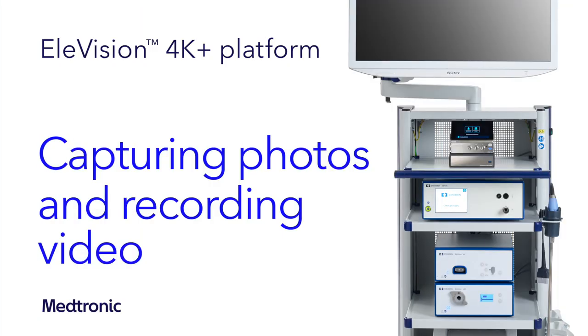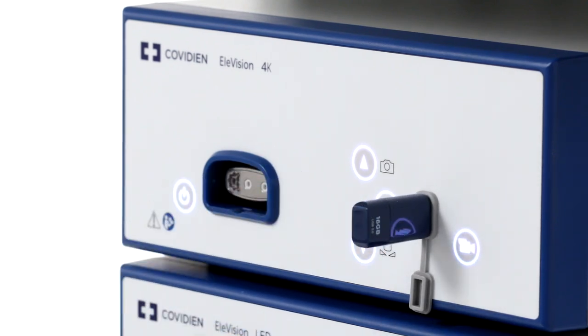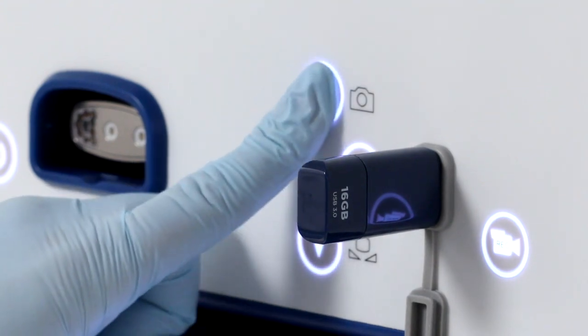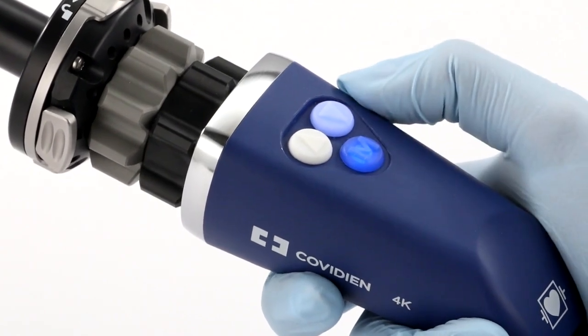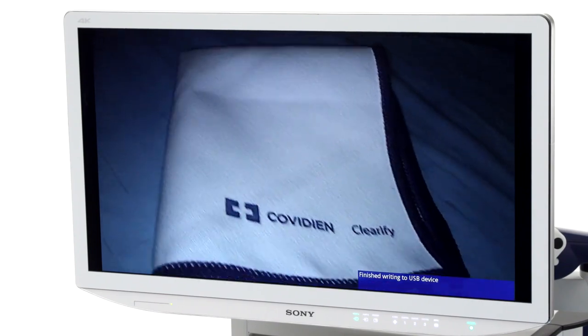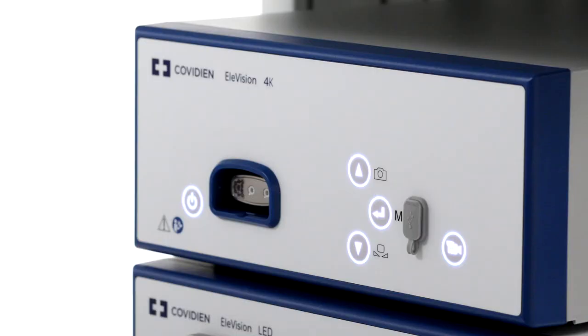Next, I'll walk you through taking a photo. Capturing a photo using the Elevision 4K Plus platform is quite simple. The first step is connecting a USB storage device to the front of the CCU. You'll want to make sure to choose a device with ample storage space in FAT32 format. There are multiple ways you can capture a photo: you can either press the photo capture button on the front of the CCU, press the menu button on the camera head, or capture an image using a foot switch if connected to the CCU. The indicator on the monitor will show a freeze frame of the photo you've captured for approximately one half second. Your photo is automatically saved to your USB storage device upon capture.